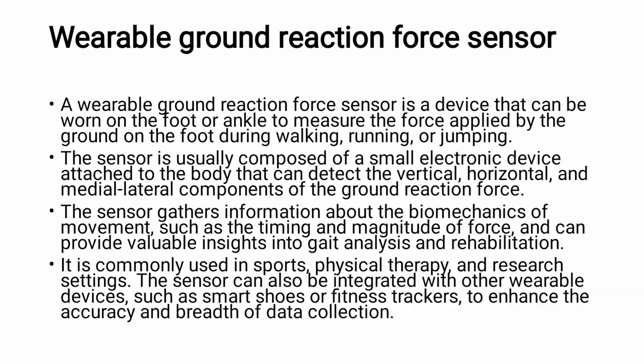It will detect the vertical, horizontal and medial lateral components of the ground reaction force. This sensor gathers information about the biomechanics of movement. It includes timing and magnitude of force, and it provides valuable information about gait analysis.